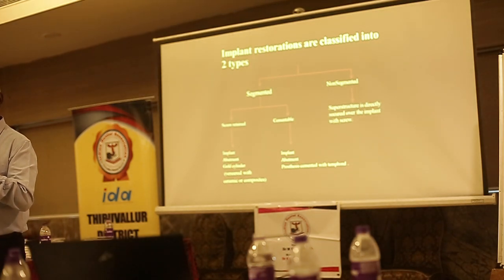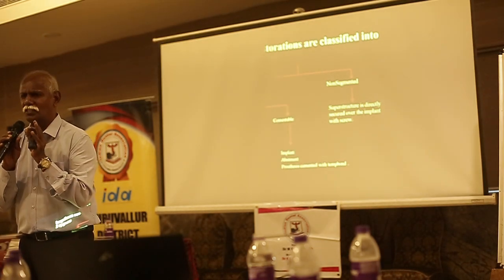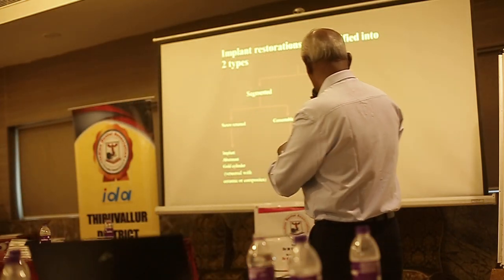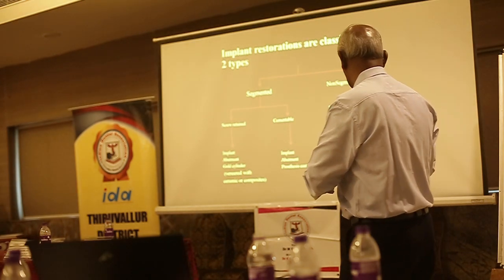Secured to the implant. So that becomes a non-segmental. Am I clear? This is how it is. This is simple. This is another thing. So we have segmented, in that we have screw-retained and cemented. Non-segmented: the superstructure is directly secured over the implant with a screw.